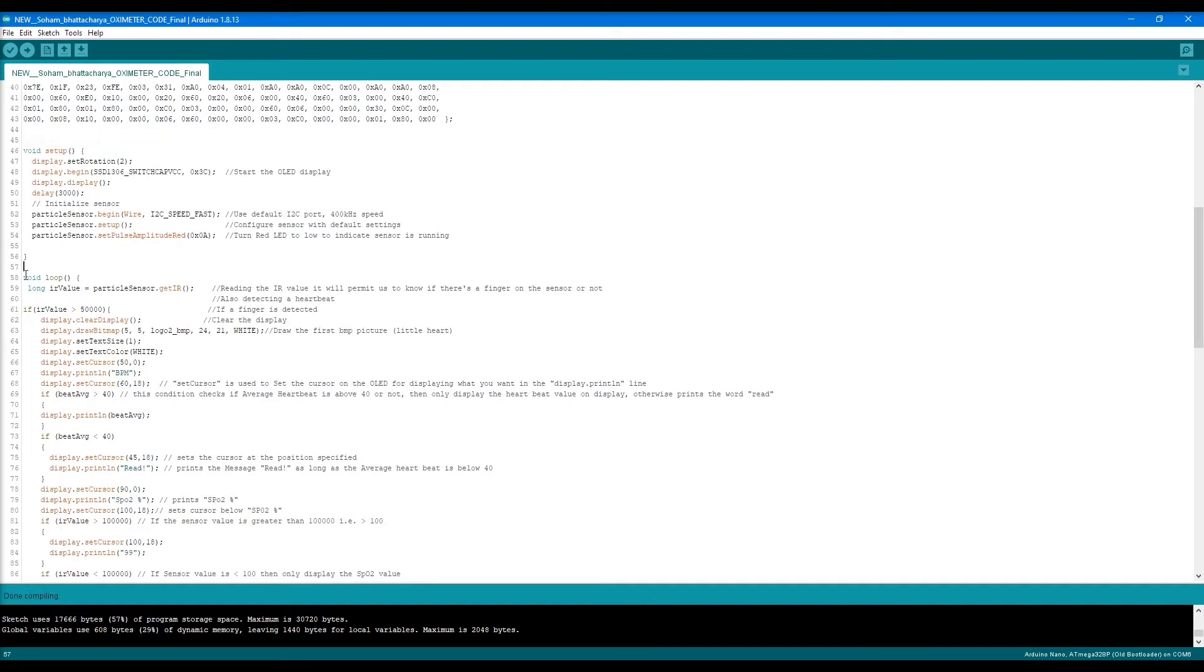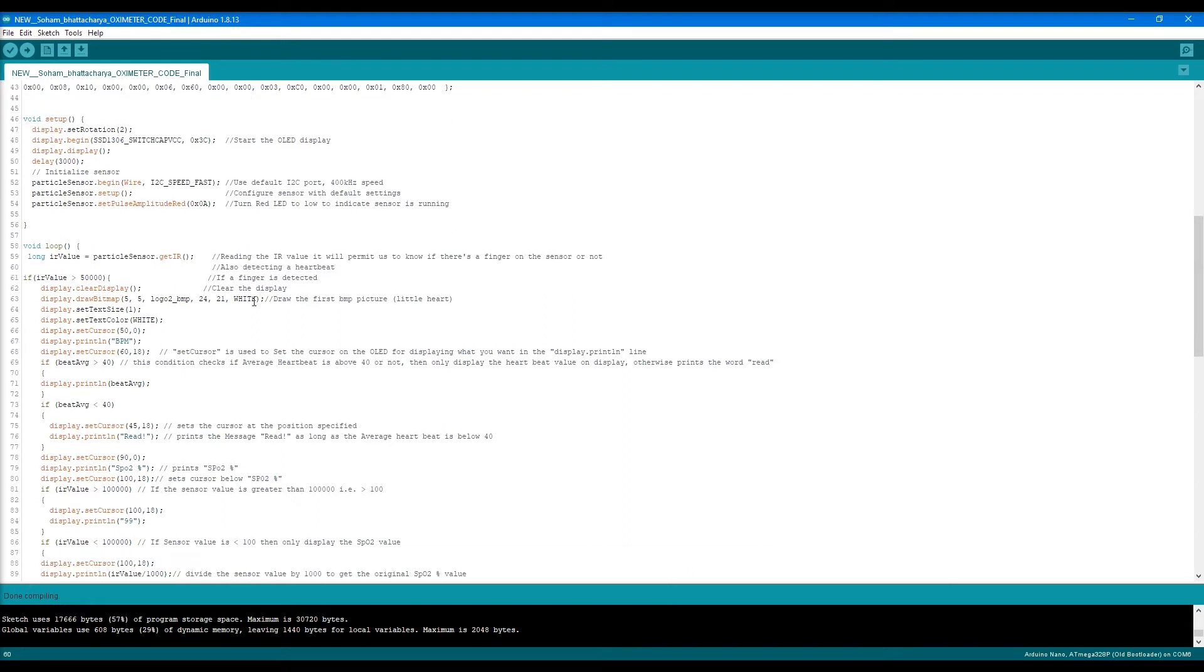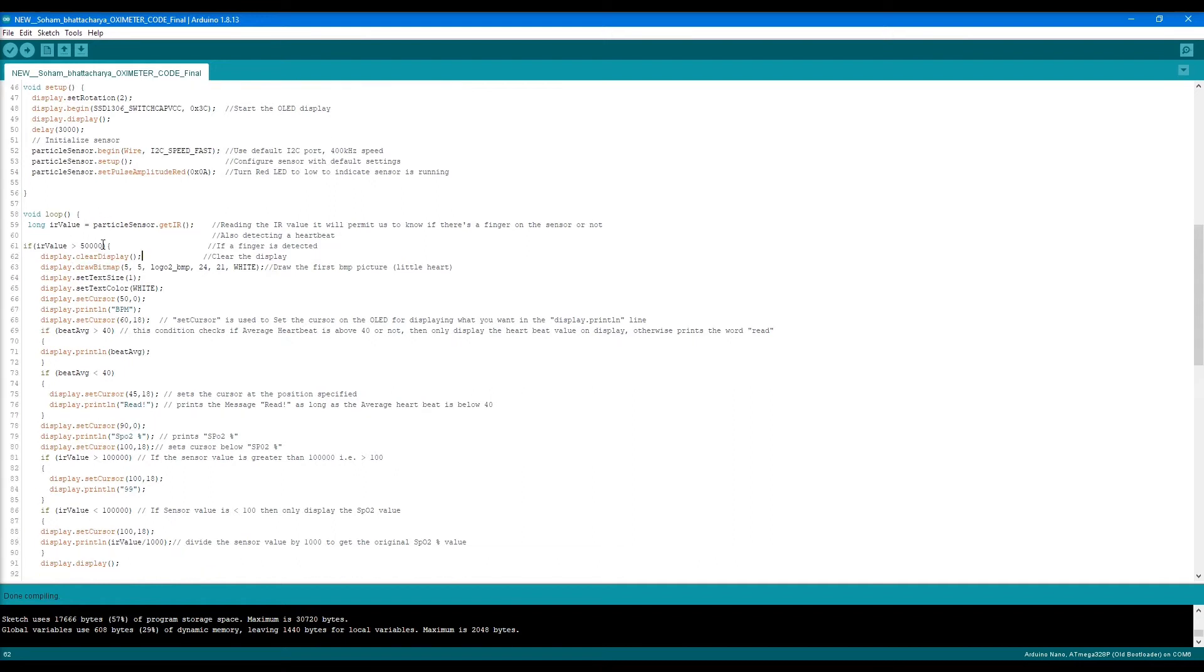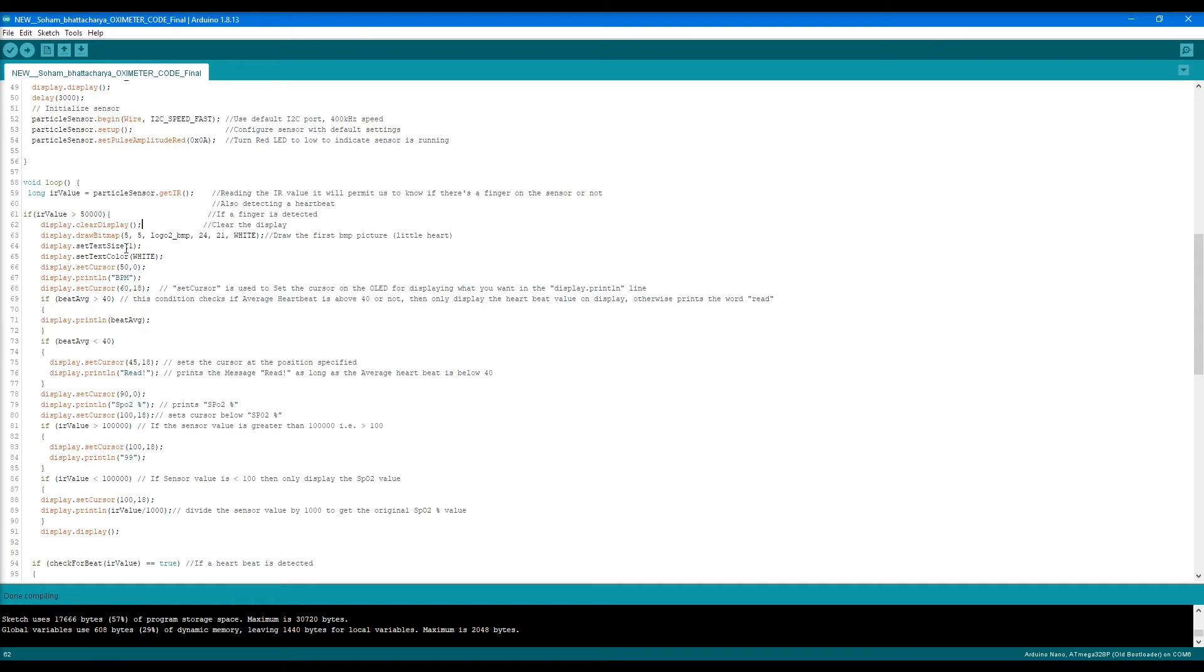Next we go into the looping stage where it gets the infrared value from the sensor and detects the heartbeat. I have an if condition: if the IR value is greater than 50,000, then the finger is placed, meaning it has detected a finger.